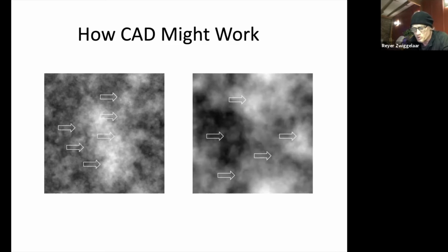And to put this in perspective, if you are doing mammography and you're a radiologist, then you might go through 200 cases in an hour roughly, and 200 cases is 4 images each. So you're talking about quite a lot of images. Most of those are normal, and abnormalities are the exception.